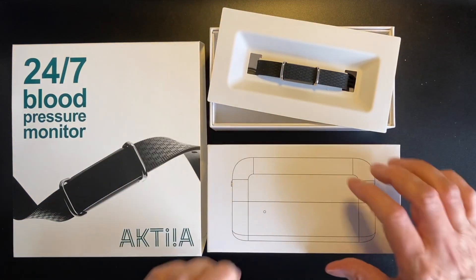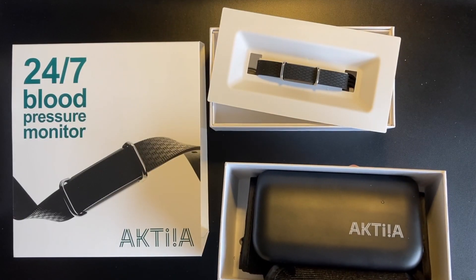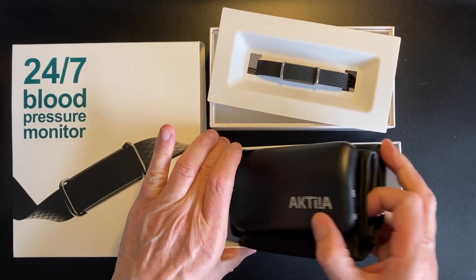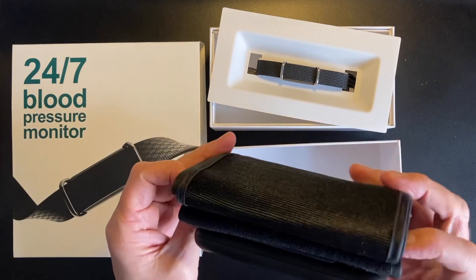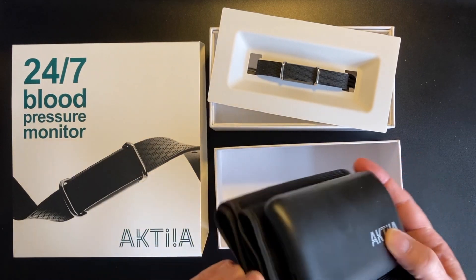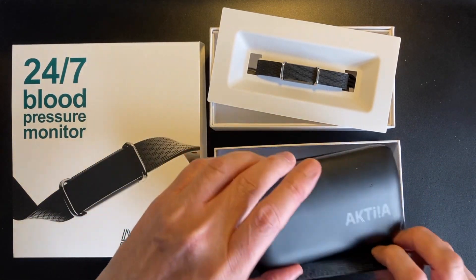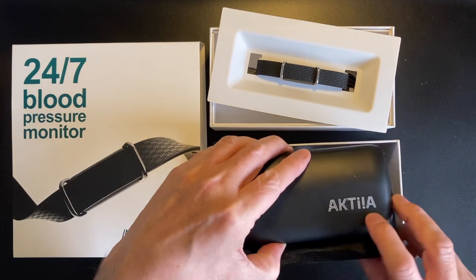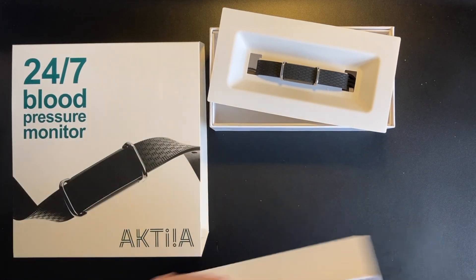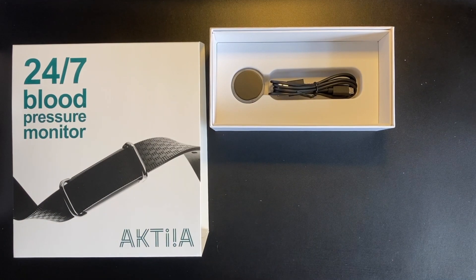In the other box we have essentially a traditional blood pressure cuff — it's Bluetooth enabled. You may ask why you'd need that: it's used to help calibrate the wearable device, and I believe it needs to be used approximately once a month. It's essentially a regular blood pressure cuff you put on to initialize the device.